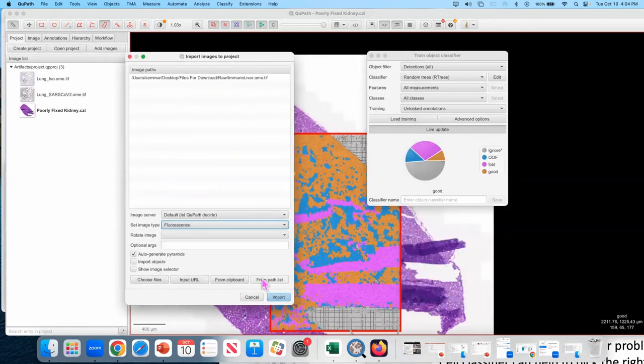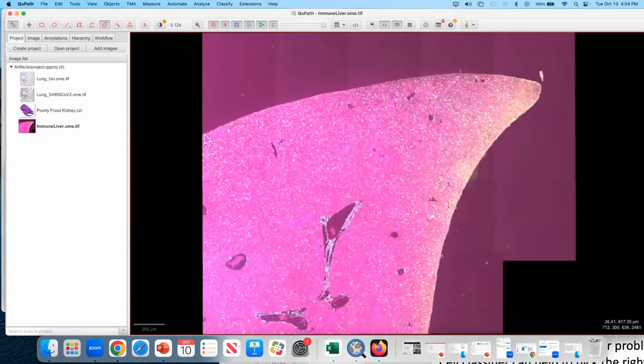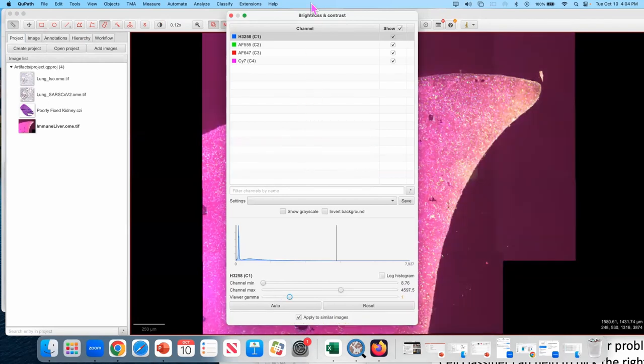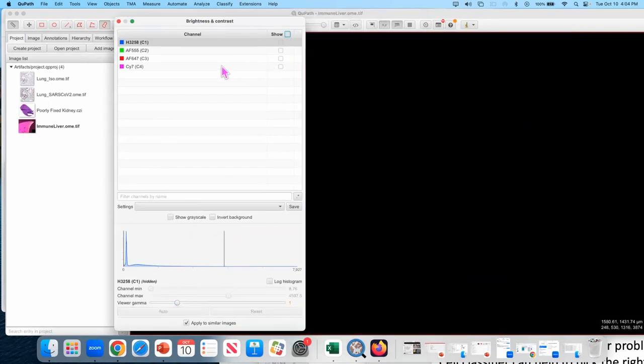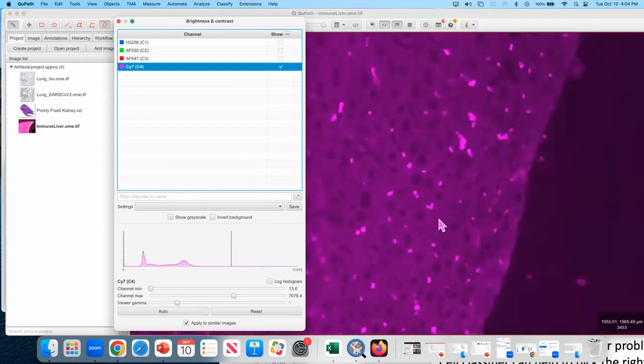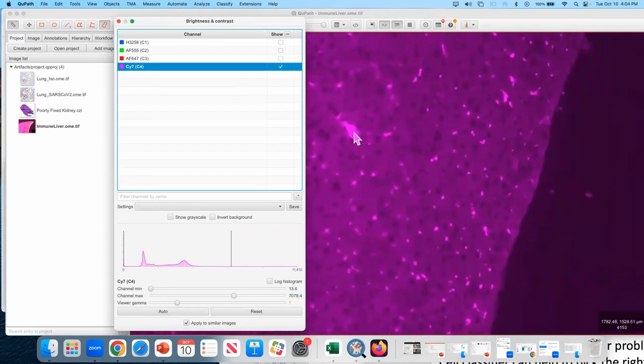It's a fluorescence image. Go ahead and adjust our display settings. I like to have my gamma to 1. I like to work with my individual channels, observe what's going on. This is supposed to be T cell stain, but we have a lot of autofluorescence and other problems in this tissue.